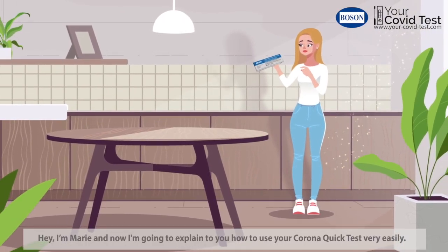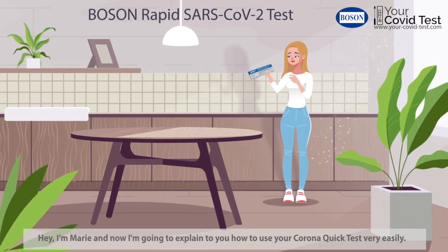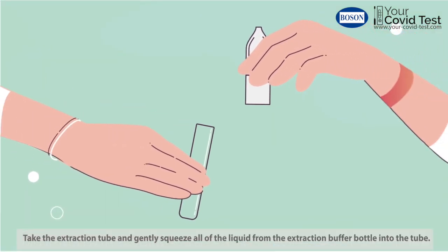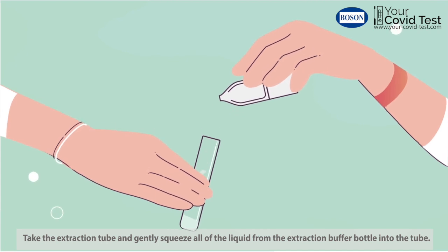Hi, I'm Marie and now I'm going to explain to you how to use your Corona Quick Test very easily. Before you start testing, blow your nose thoroughly. Take the extraction tube and gently squeeze all of the liquid from the extraction buffer bottle into the tube.